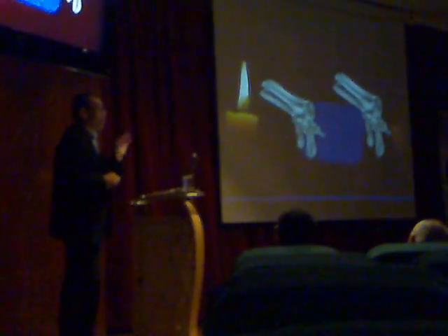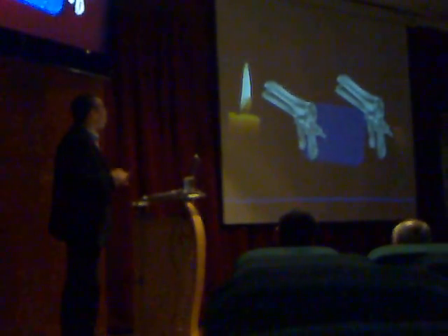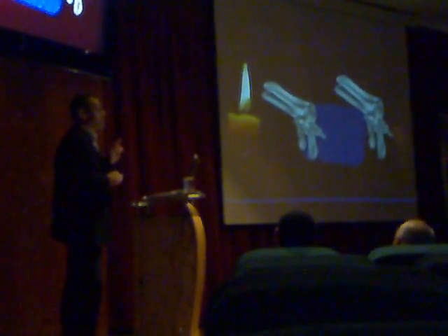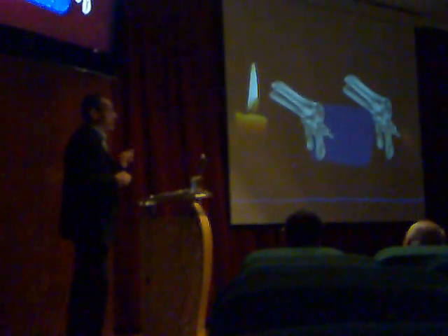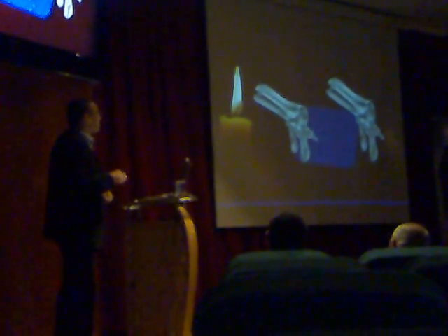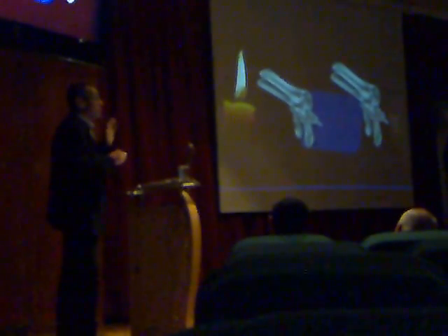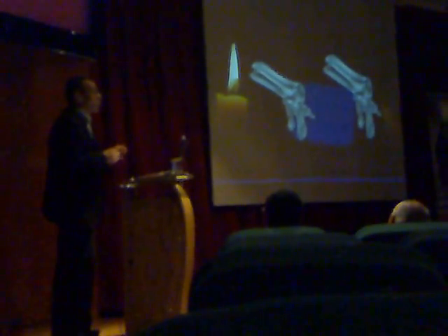Please don't use gel. Lubricant is tap water. It is the most suitable one. The gel interferes with the interpretation of the result, and the end result is unsatisfactory. If it is mandatory to use gel, please apply it in a way not affecting the cervix, but it is not recommended.